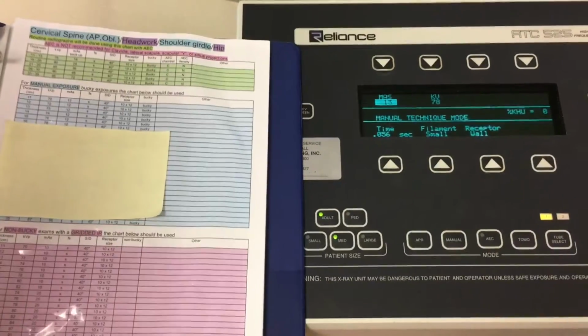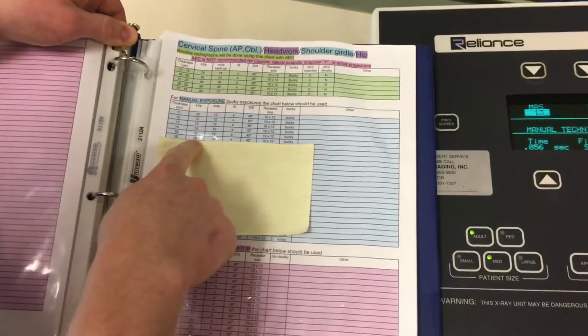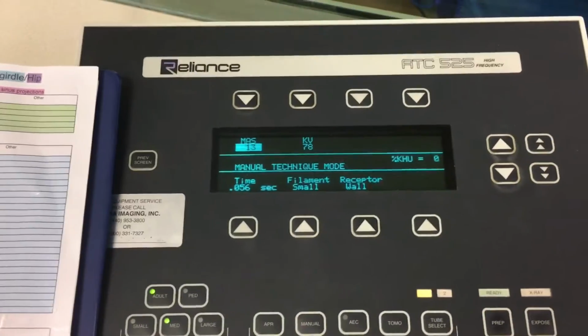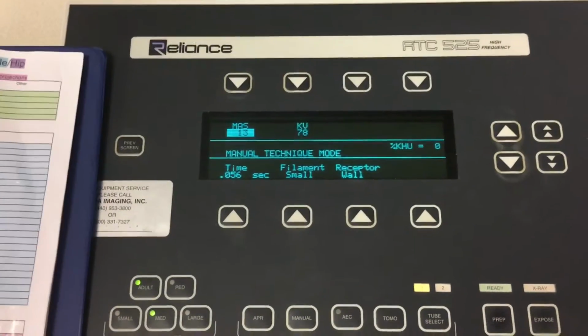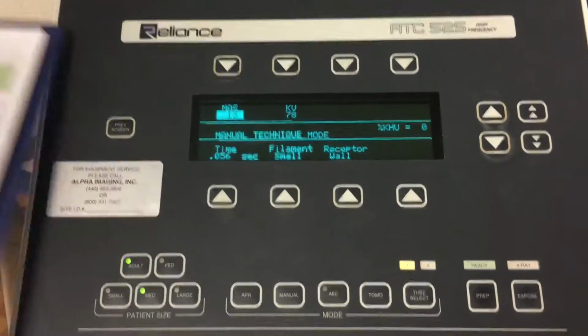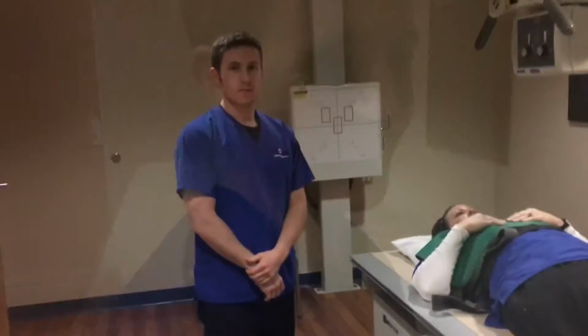Okay, so my part measured 16 centimeters. So using the headwork page in my exposure chart to set a technique here, I've got 13 mAs at 78 kV. Small filament because we are looking for bony detail, and I am on my wall receptor. Breathing instructions for this projection are suspended respiration.